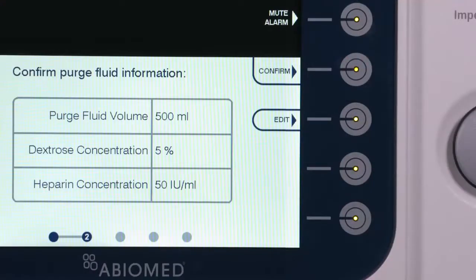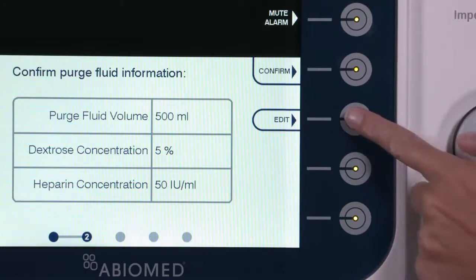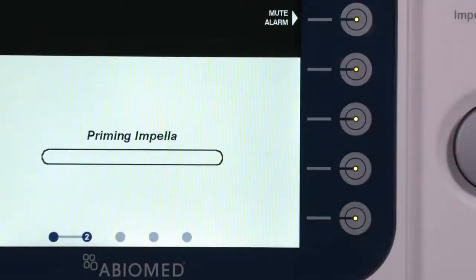Enter the Purge Fluid information. If the values need to be adjusted, press the Edit soft button. If the default values are correct, select Confirm to verify these values. The AIC will move to the Prime Impella screen.